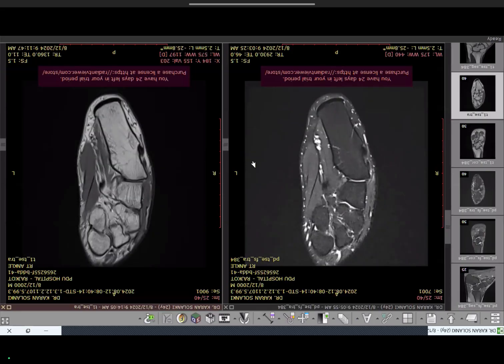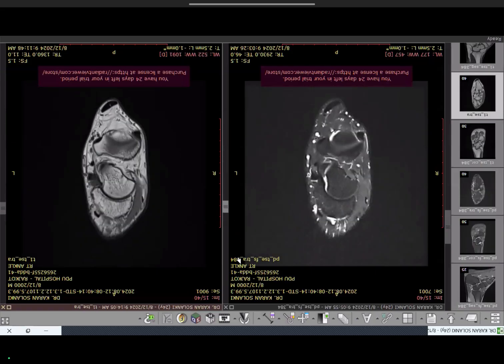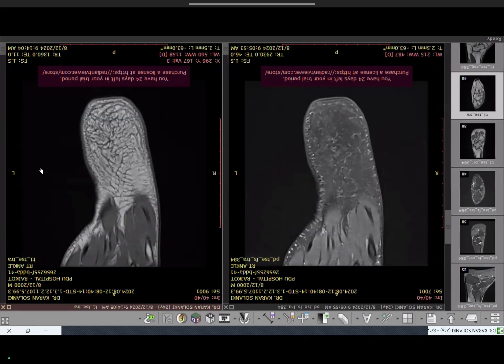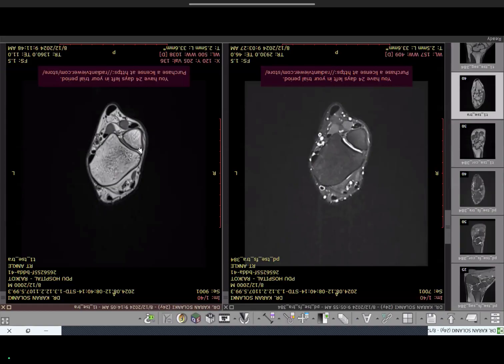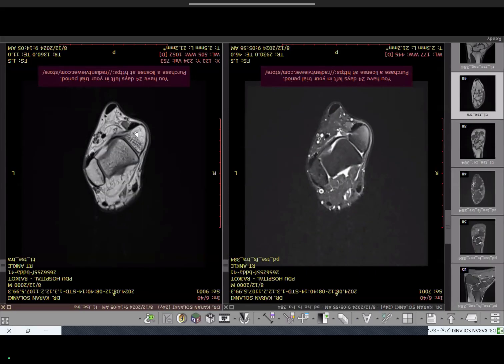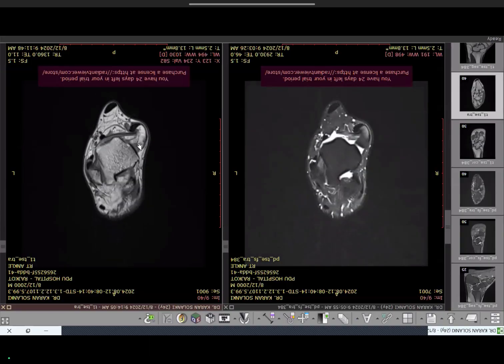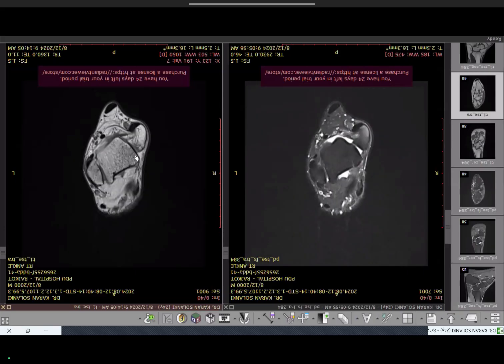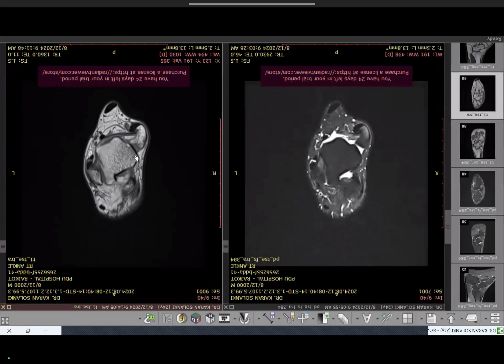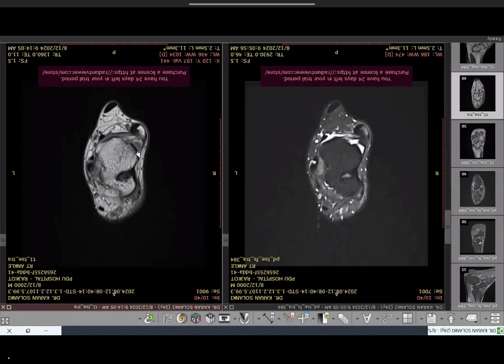A ganglionic cyst can form at this level because of friction and can irritate the medial plantar nerve. Now for the ligamentous anatomy in the axial sequence: in the superior most section we can see a thick band — the anterior inferior tibiofibular ligament — a very strong ligament not torn easily. Coming further down, a small band attaches the fibula to the talus — the anterior talofibular ligament. In some cases you can see two separate bands of the anterior talofibular, as in this case.